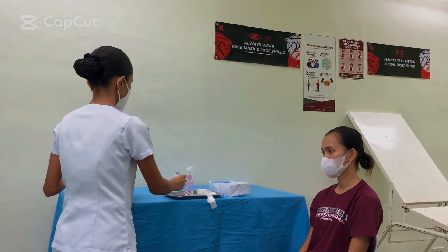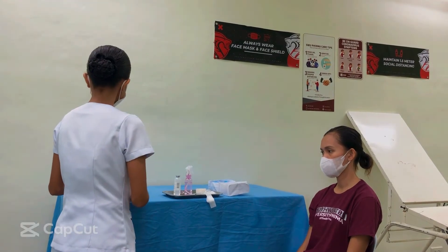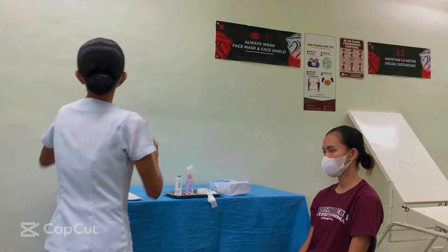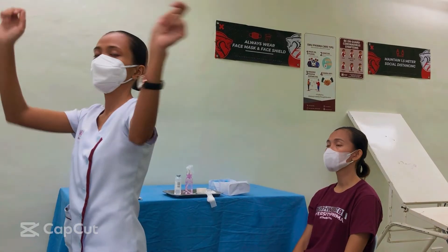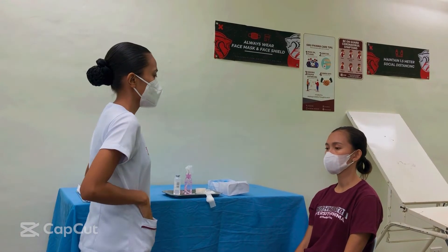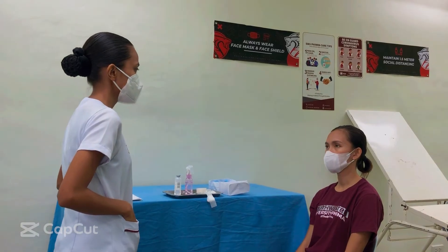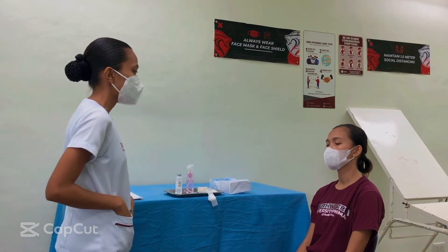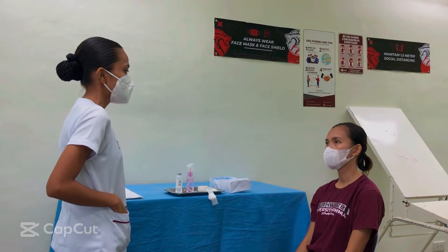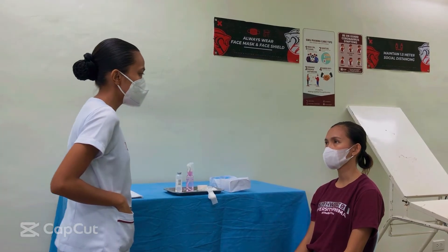Step number four: close the room curtain or door. Introduce yourself and identify the patient using two identifiers — name and birth date, or name and account number — according to facility policy.